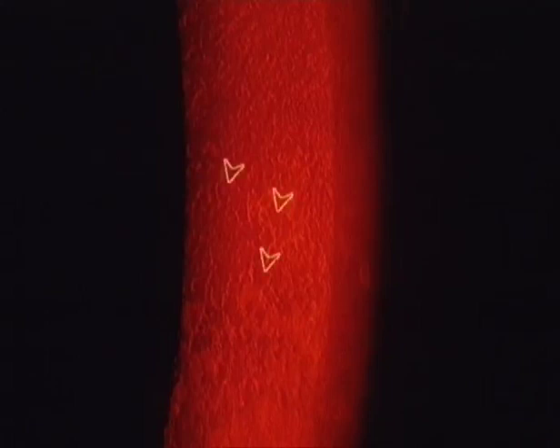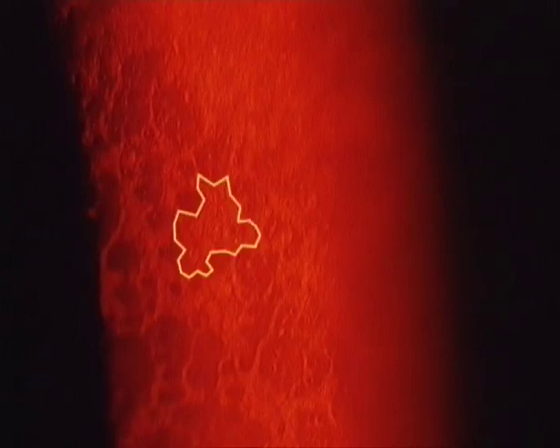With the contact glass, we see the posterior reflex pattern with its interrupting drusen here, and here the rather flat anterior Descemet reflex. Note how the reflex patterns change with every change of the illumination angle. Here, at high magnification, where the drusen are closely packed, there is little space left for endothelial cells. But if we move towards the periphery, the drusen become scarce, and we find more and more endothelial cells.